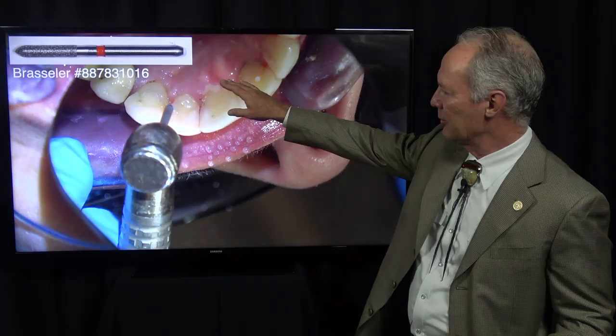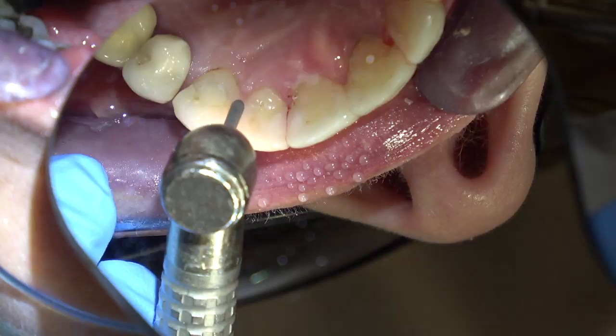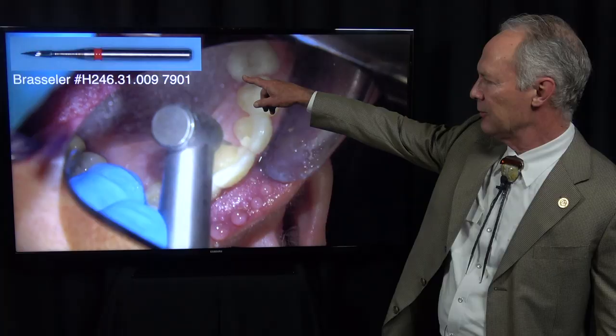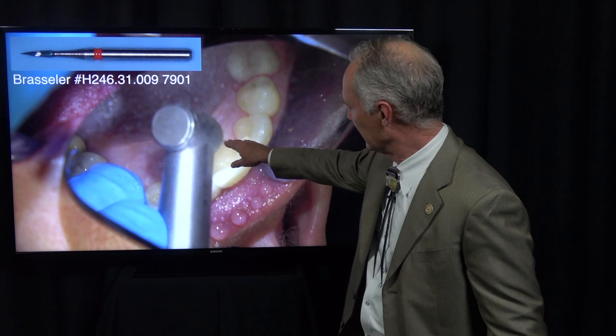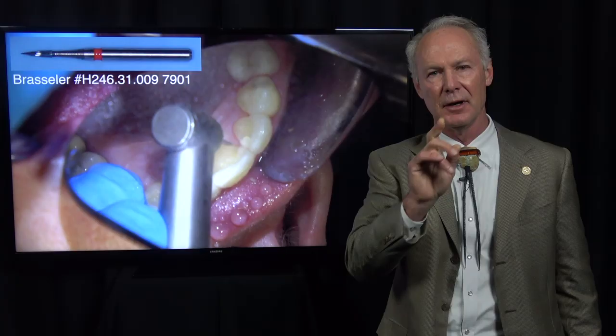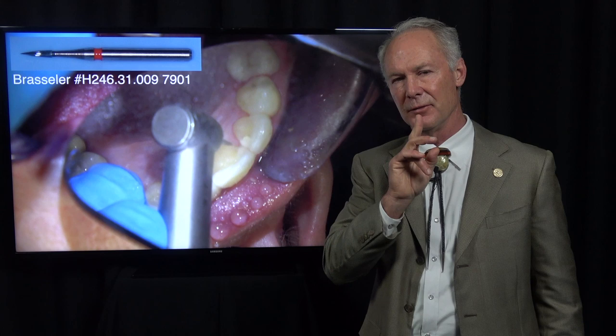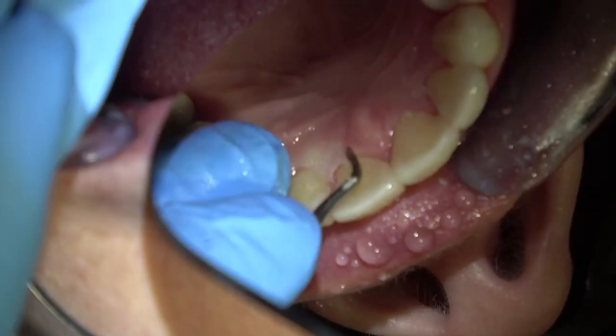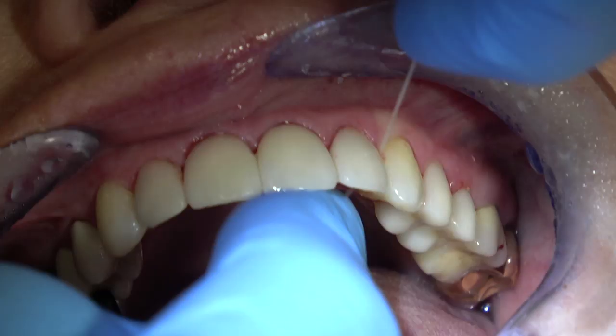Once we've done that, we're going to come back with a large, fine chamfer diamond and remove the excess from the palatal. Light touch, lots of water. So you use this 12-fluted carbide burr in the interproximal and on the palatal of the veneers, and also at the facial gingival margin of the veneers, to just thin that margin and be sure that there's no excess luting composite there. I always use this carbide burr interproximally and on the palatal and on the facial in the polishing direction of the handpiece, not the cutting direction, to be sure there's no excess luting composite on the facial and that that margin is perfectly polished down to the tooth. Just light, light pressure, then check with the round end of that amalgam carver to be sure there's no edge, that everything's smooth, then floss again.